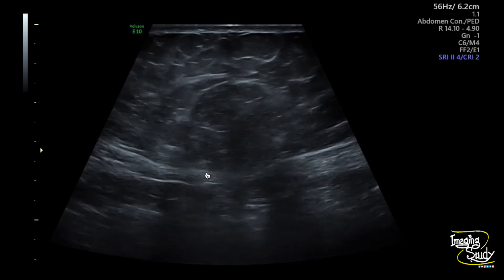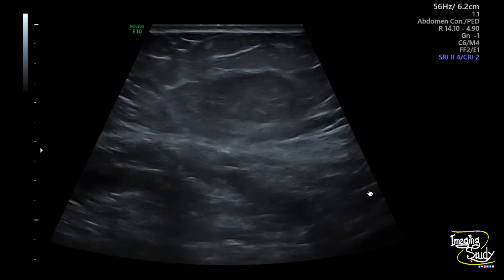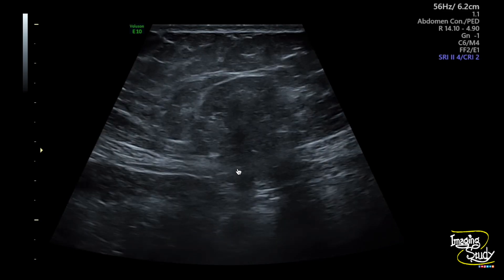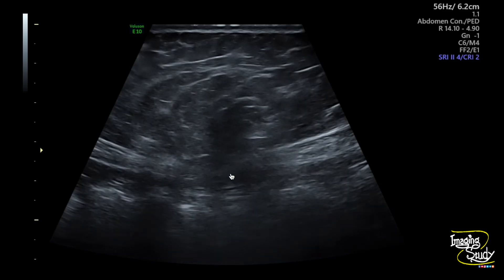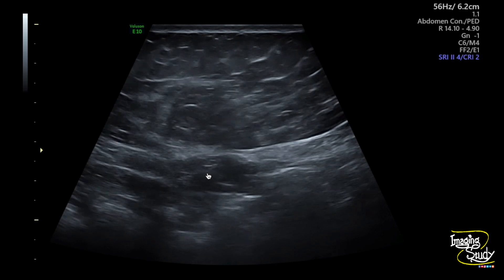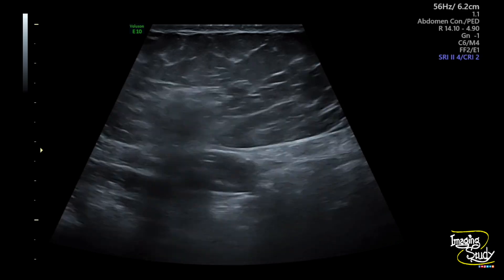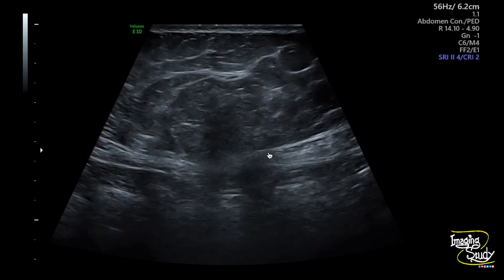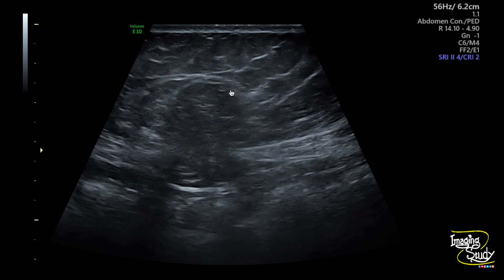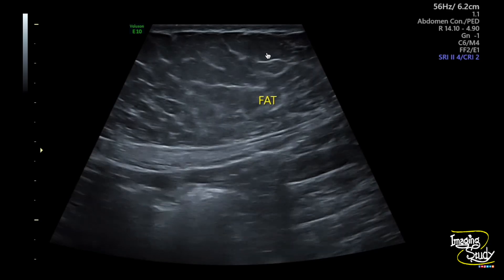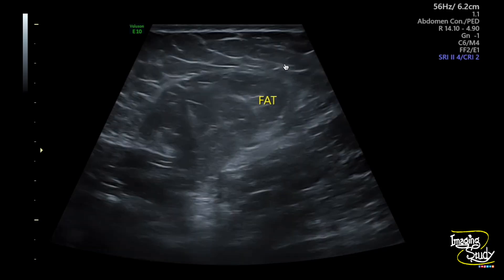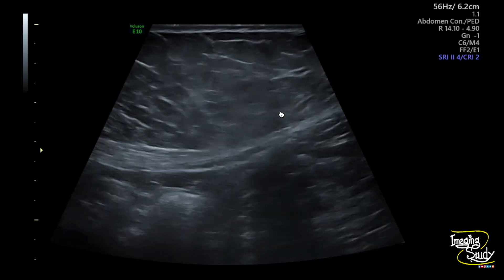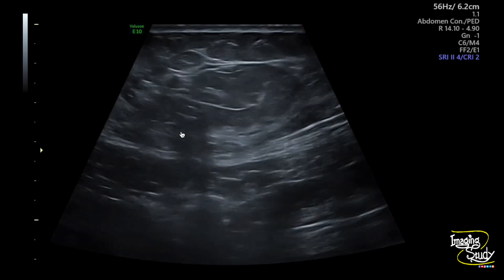Here you can see the epigastric region on high frequency ultrasound. You can see a gap at the midline — this midline gap is the hernial orifice. You can see a herniated sac here. If you see the echotexture of the content, it looks similar to the subcutaneous fat, so this content is the omental fat.